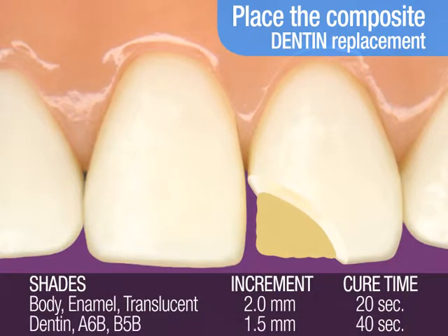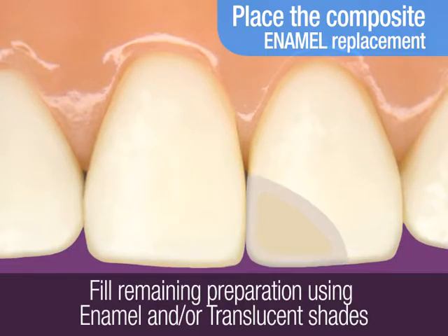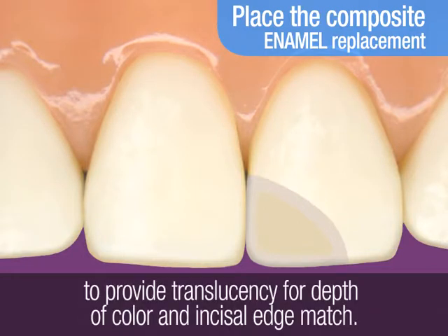the cure time is 40 seconds per 1.5 mm increment. Now you're ready to replace the enamel layer of the tooth. You can fill the remaining preparation by using either an enamel shade or both an enamel and translucent shade. Adding a translucent shade provides translucency for depth of color and incisal edge match.